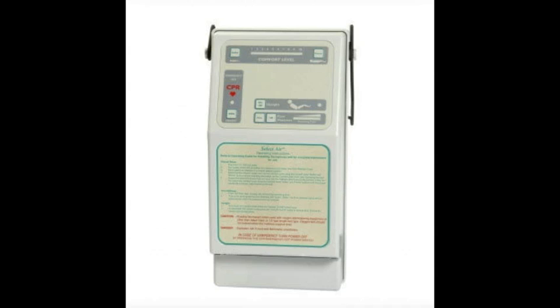Before placing the patient onto the bed, ensure the bed rails are up for safety and press the firm button on the panel. This button is located to the right of the on button. Place the patient centered on the bed. Use the weight chart given to assess which setting the comfort level should be at. This comfort level dictates the softness or firmness of the mattress. For example, a 100-pound person should be on the comfort level 4. This is displayed at the top of the unit with a number scale.